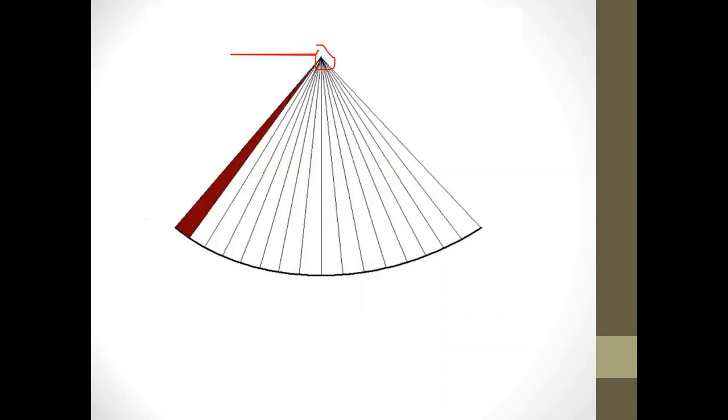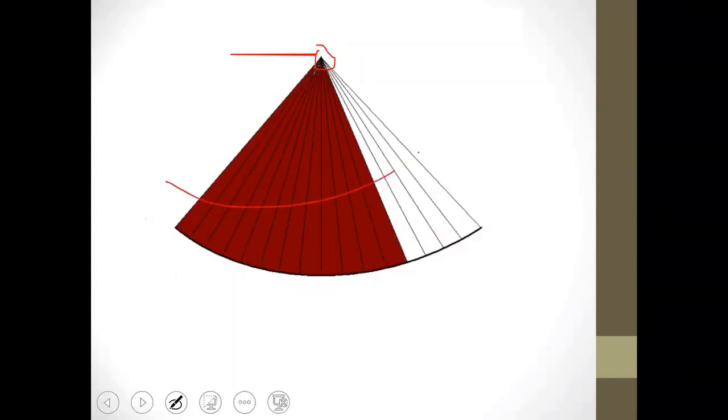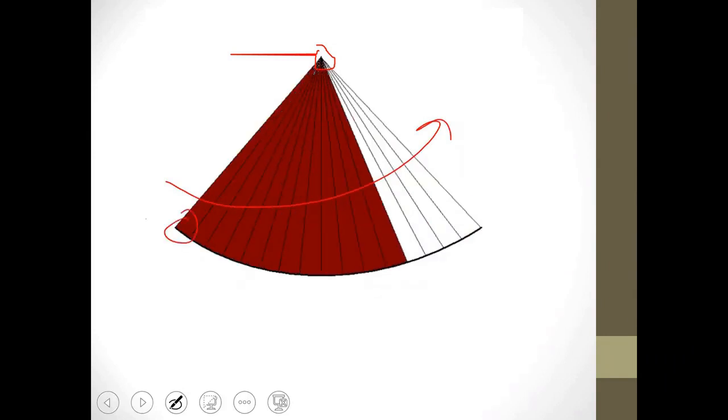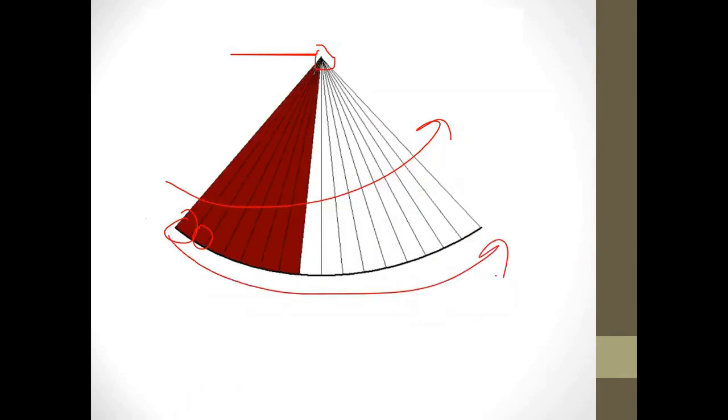It's like you're taking a certain large field of view, but moving, for example, from side to side. How does this happen? You are focusing here and then moving from this direction to that direction.